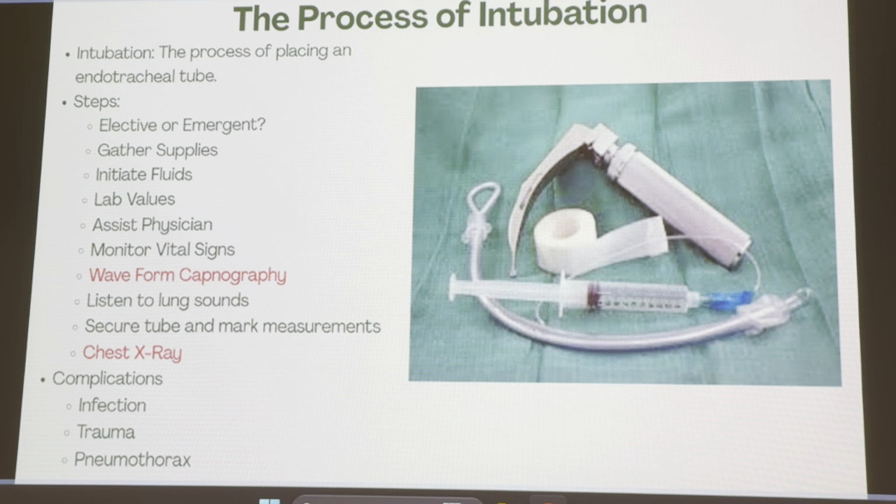Great. So when we're intubating some people, we can also have complications as well, and this is going to tie into that mechanical ventilation piece, about the different types of complications. Infection. This is not a sterile procedure, but we hope to have it as clean a procedure as possible. With that, there's potential for that aspiration risk as well. And so we have some of those foreign bodies getting into that lung space. We potentially develop some type of aspiration pneumonia.